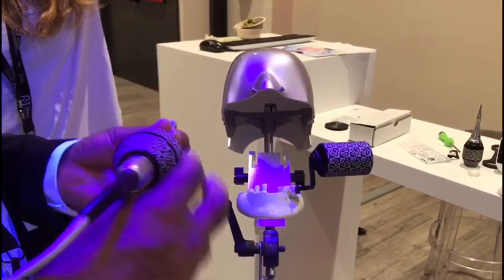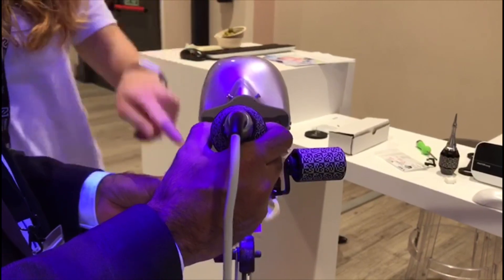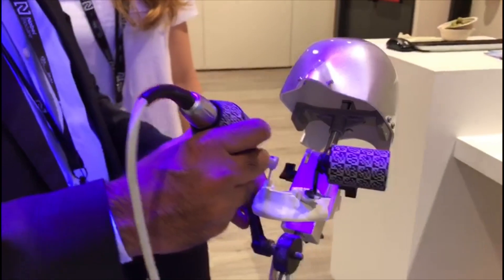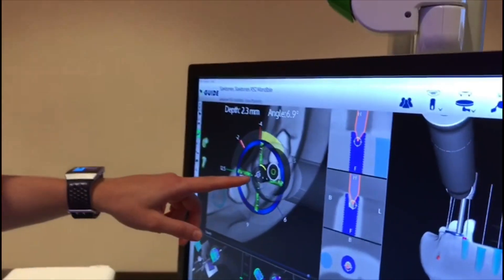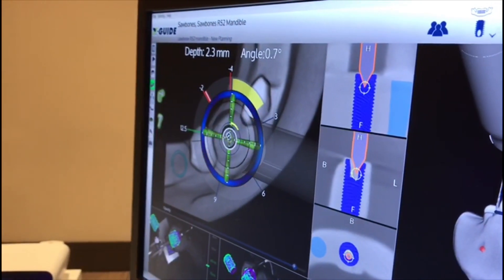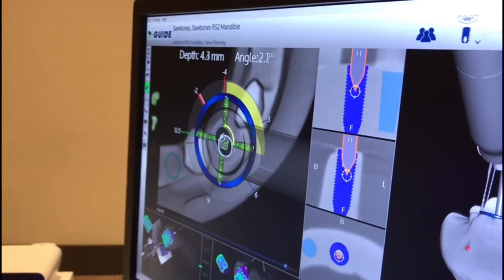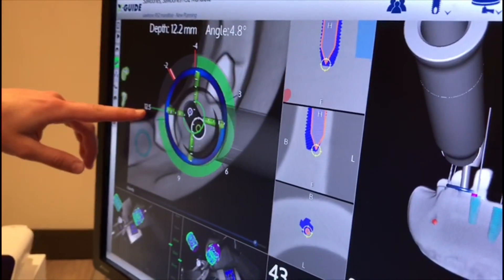There's a model right here. Which spot shall we choose? We're at 4-3. Now I place this here and get the coordinates. You're going to need to line up the green with the blue circle — now you can start drilling. You're guided all the way, and you're going to stop when you get to 12.5.